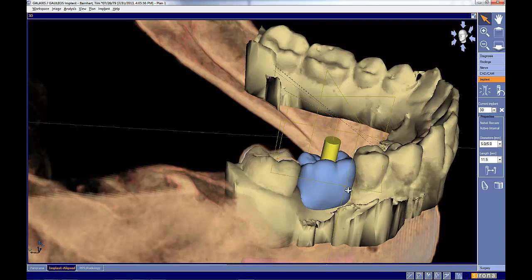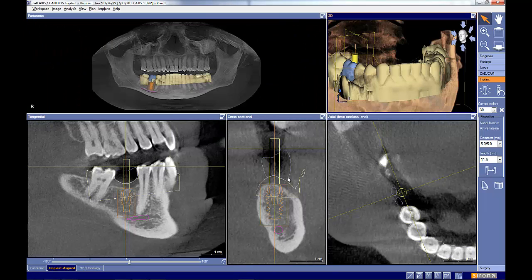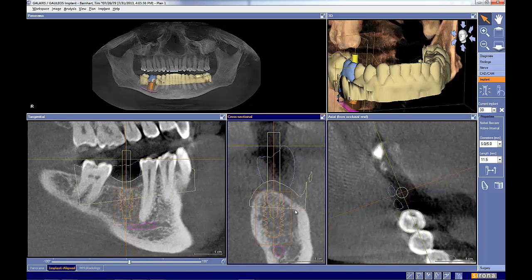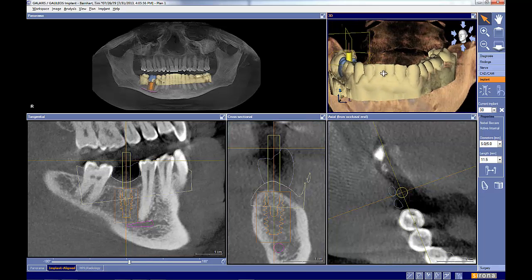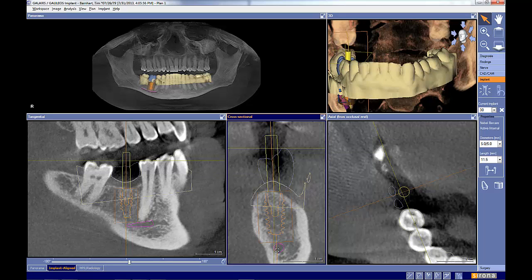So again, the implant plan itself is fantastic. And if we had our margin here, we would see that we have more room to build the emergence profile even with a slightly higher placement. But again, going with this, I think your plan is absolutely excellent right here. The only thing I would say in looking at this from this angle is, we know that lower teeth are tipped in a little bit. This implant looks to be coming straight out, and we can see our tooth is properly designed and tipped that way. So more than likely, I would probably just tip that implant slightly that way.